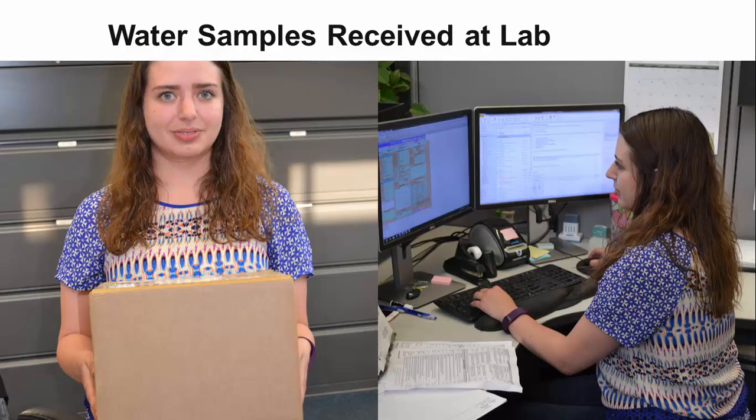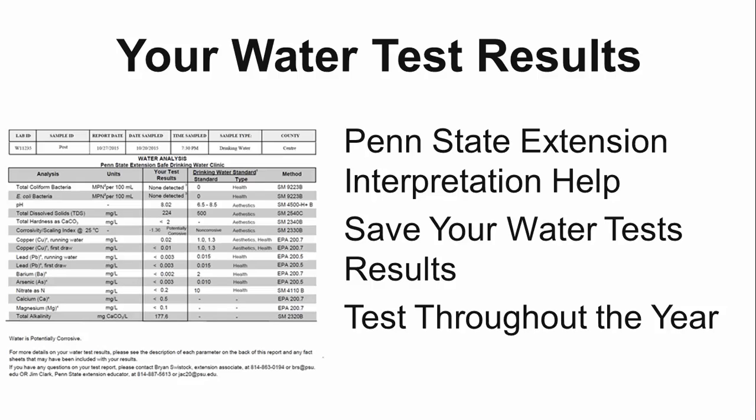Once the water samples are received at the lab they will be unpacked, and if a bacteria analysis is requested the samples will be processed immediately. It takes 24 hours to complete the bacteria test at the lab. If a positive bacteria test is determined you will be notified immediately, even before your other water test analyses are completed and a final water test results sheet is created. Your sample submission form is used to enter your data into the computer so your samples can be tracked as they are processed and a final water test report can be generated and emailed or sent to your home. Penn State takes the extra step of listing Penn State Extension personnel and their contact information at the bottom of your results in case you have problems understanding your test results. It is important to save all your water test report results in a safe place so you can compare these numbers with future water tests.